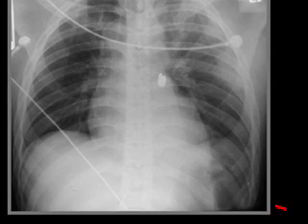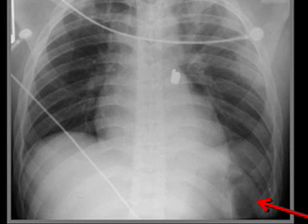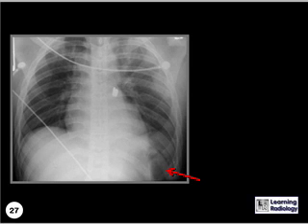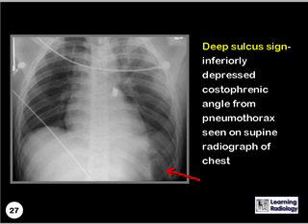What sign is being demonstrated here? This is the deep sulcus sign, which is the inferiorly depressed costophrenic angle from a pneumothorax seen on a supine radiograph of the chest.